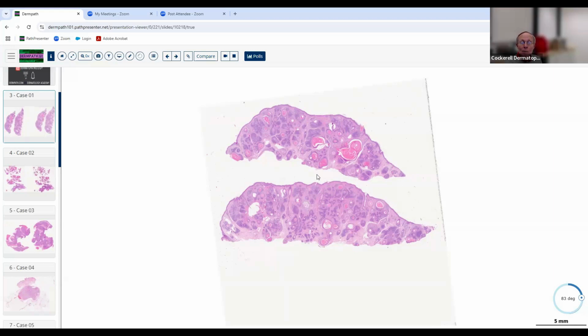And if you draw a line down the middle of it, it pretty much looks the same on one side as it does the other. Now, another thing you can do is look at the individual aggregations of cells. So if you have just a part of something and you can't really apply those criteria, you can look at the individual aggregations that are comprising the lesion.